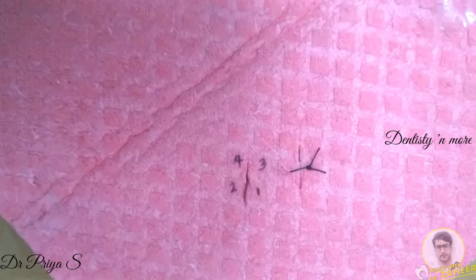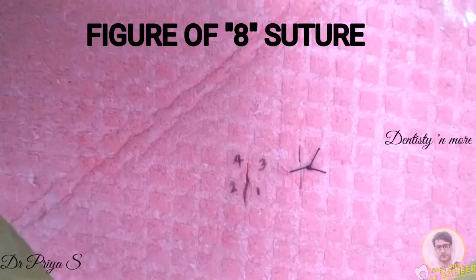The second suture technique is figure of 8. This is typically used in closure of extraction sockets. Any extraction socket will have 4 interdental papillae.